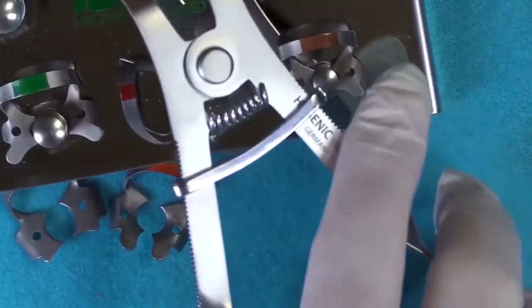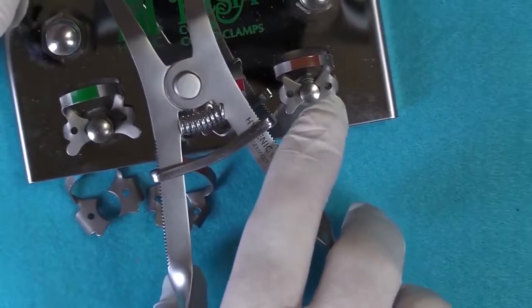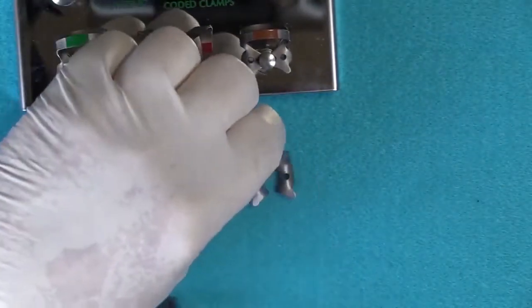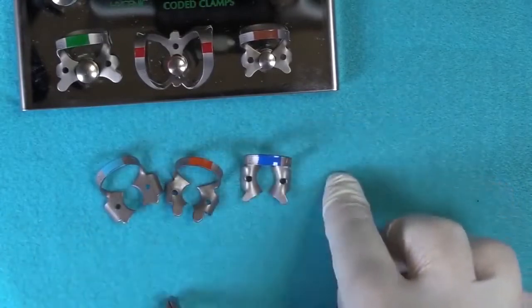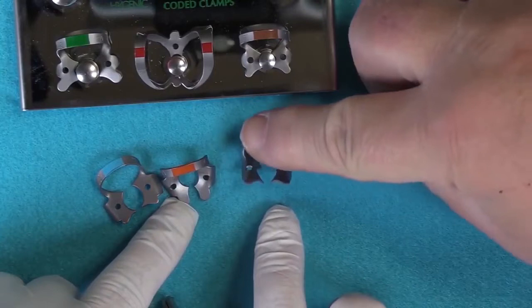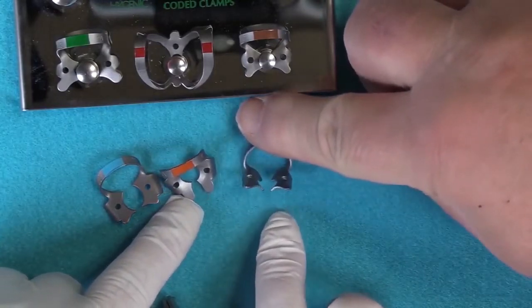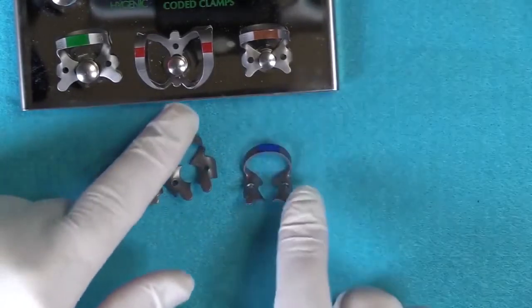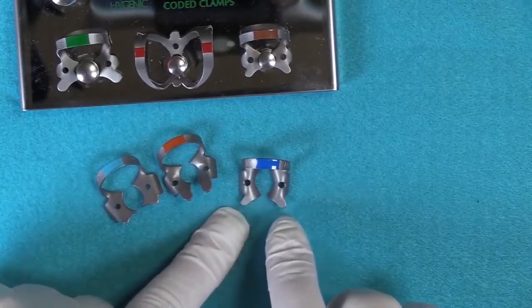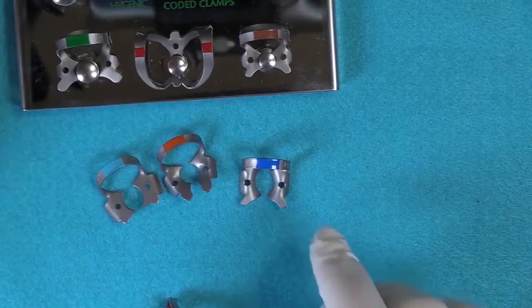And then you have your subgingival style clamps, such as this one here. Can you see even further? It's curved, but notice how the points of the jaws dip really down in a gingival direction. And these can be used either upper or lower arch when you have a partially erupted tooth, or if you have an oddly shaped tooth.